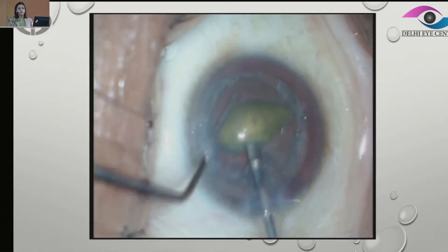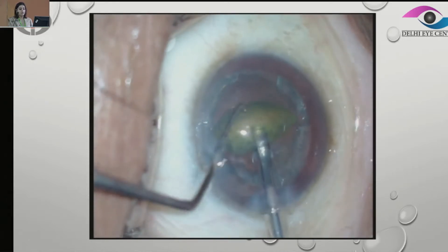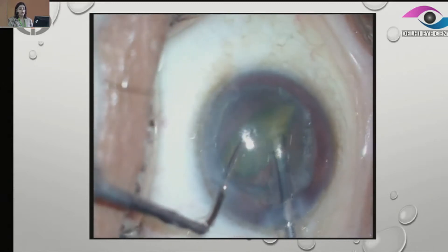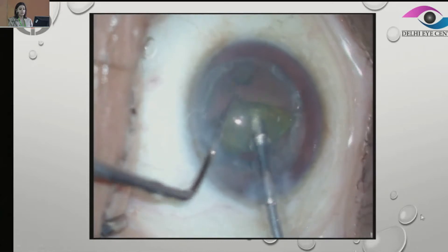We can prolapse the entire nucleus since it's very soft and we don't really need much phaco energy. In this case, we can directly chop it into two halves and then emulsify it. This makes it very easy.